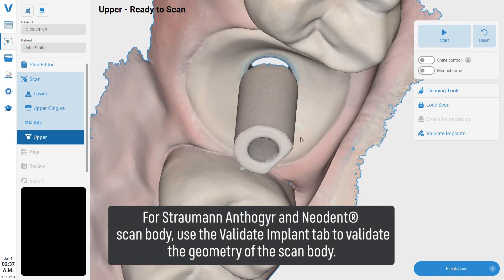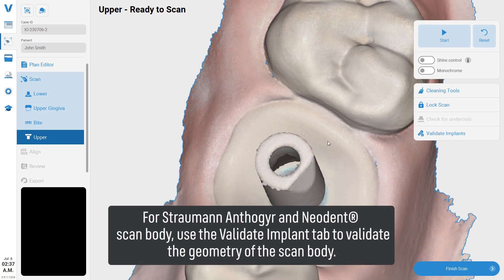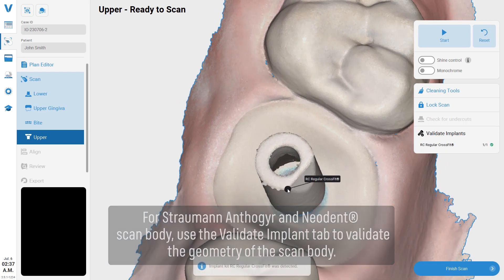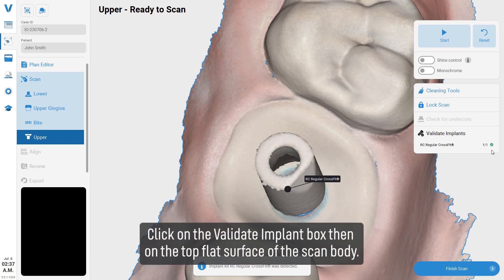For Straumann, Implant Direct, and Neodent scan bodies, use the Validate Implant tab to validate the geometry of the scan body. Click on the Validate Implant box, then on the top flat surface of the scan body.